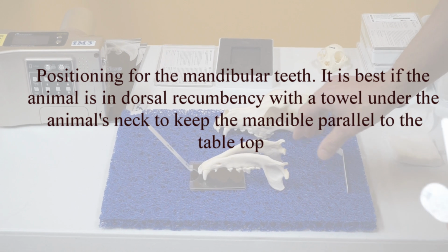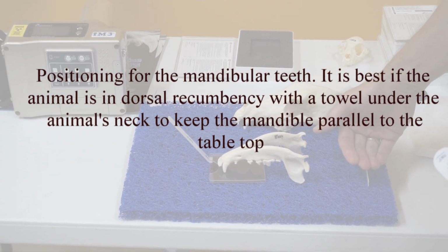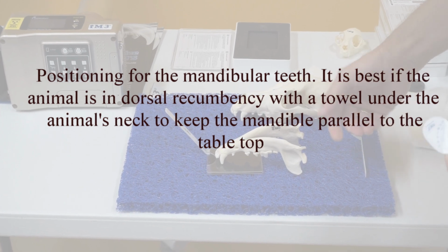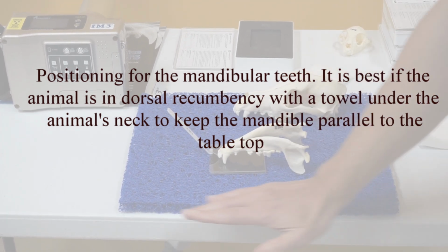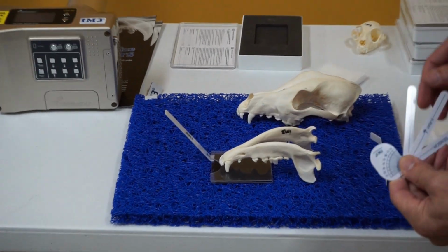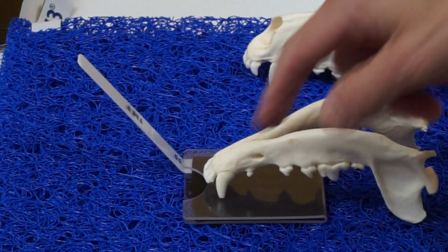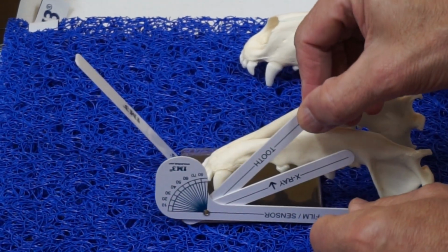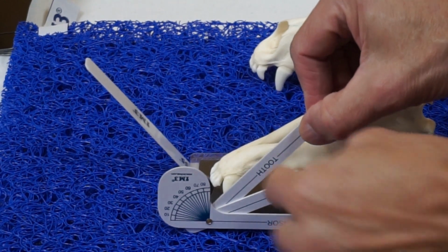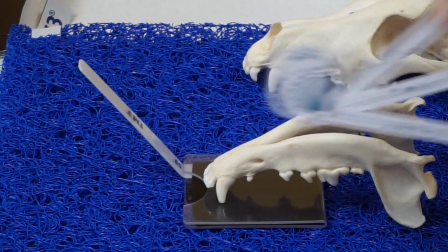So normally they'll be in dorsal recumbency. We have a little towel under their neck, so it makes their mandible parallel to the tabletop. The film, size 4 film, is inside the mouth. We look at the long axis of the tooth and the long axis of the plate, and that will form an angle, and then we'll come in at right angles to that bisected angle.